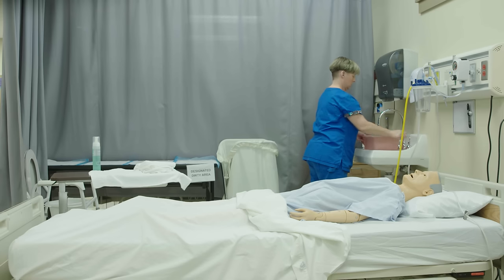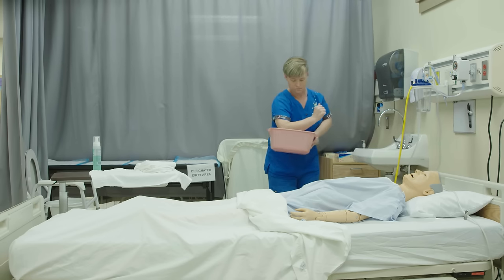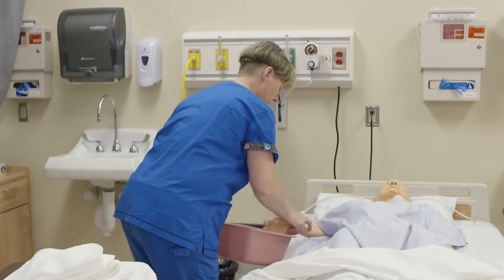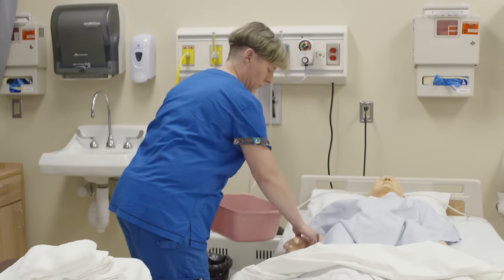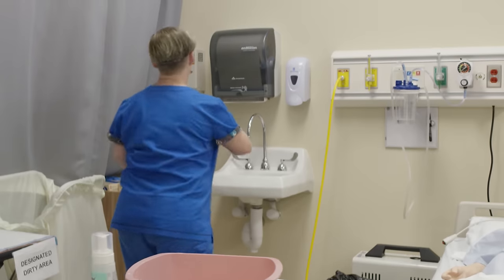Before washing, the candidate checks the water temperature for safety. We do this using our elbow to ensure gloves are easily placed over the hand. After checking temperature for safety, the client is asked to verify comfort of water. I'm gonna wash my hands.